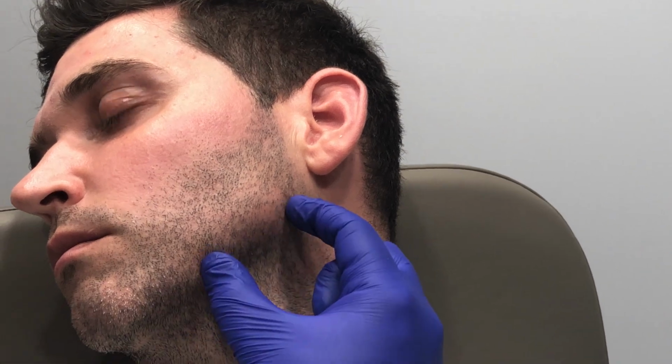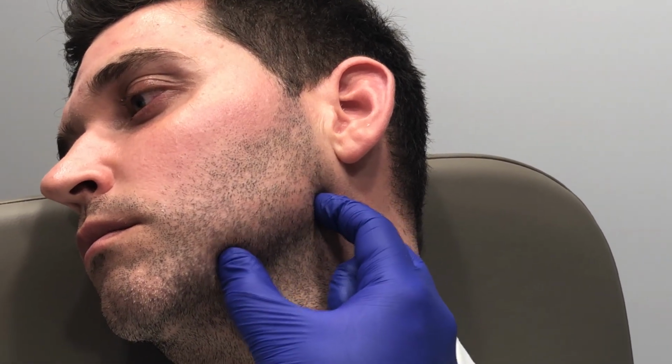But in order to keep him balanced and harmonious, I want to work on giving him just a little bit more posterior width on that jawline to keep it looking nice and masculine. We're going to do a cannula type technique and start with using some Voluma first through the jawline.